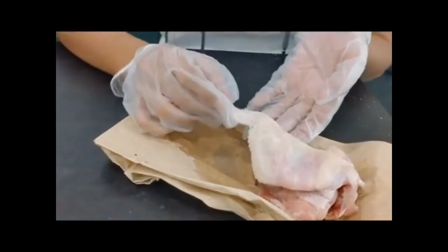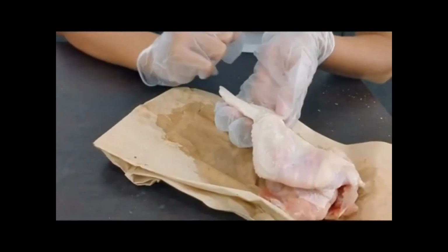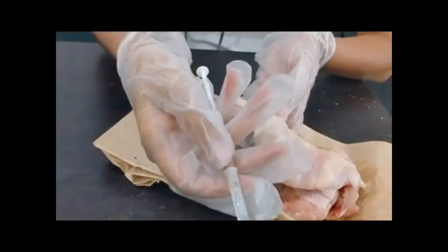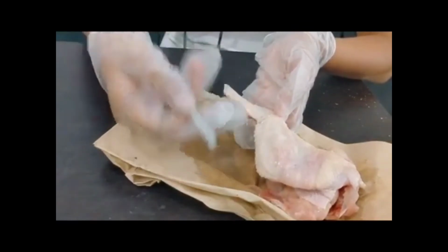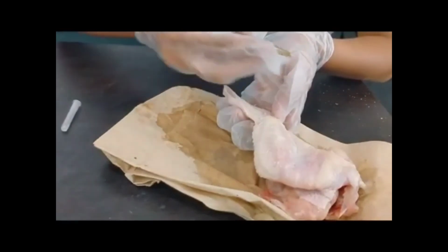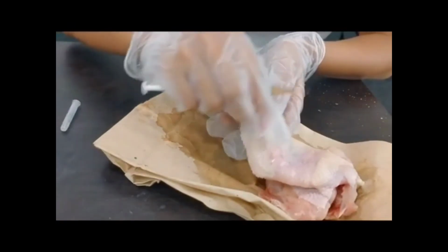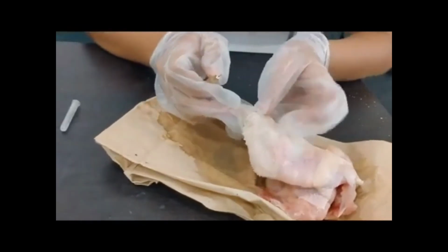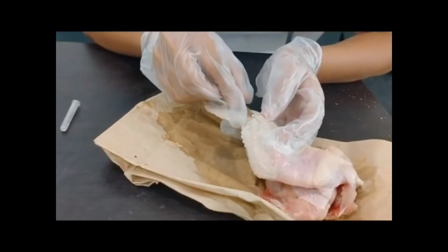So, sir, can I lift up your arm? Yes, po, sir. Thank you for cooperating. We will now get the tuberculin. So I have here some already tuberculin syringe with 1 ml of sterile water inside that is ready. So now I'm going to open it, sir. And then let's just relax po. Alright.